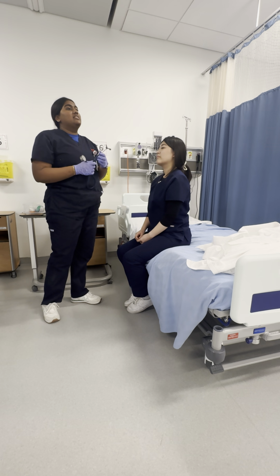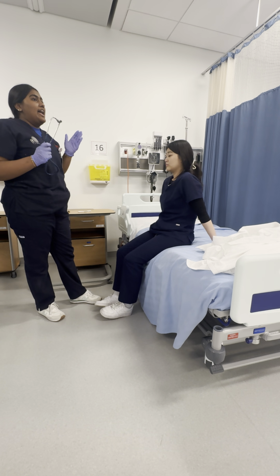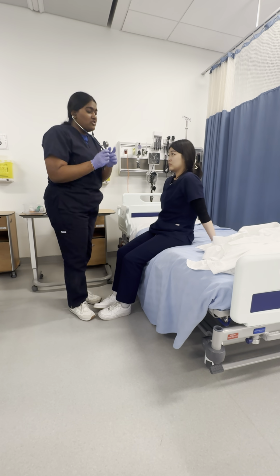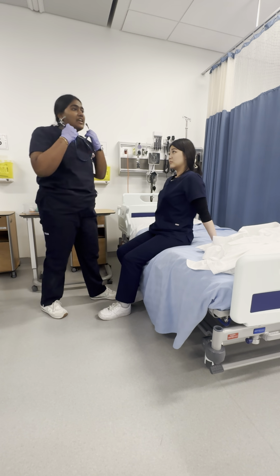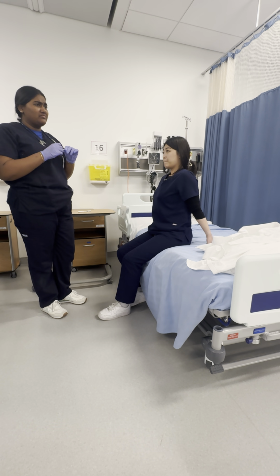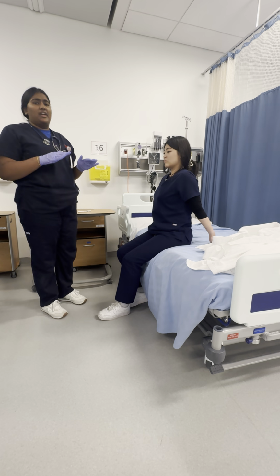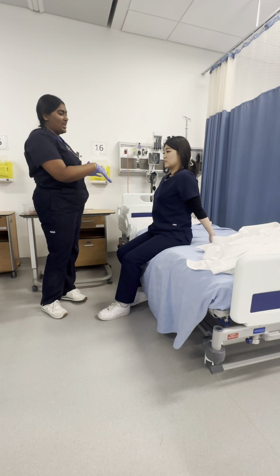Her apical heart rate was 76 beats per minute, and the rhythm was regular and unlabored. Now I'm going to see if I can hear the S1 and S2 sounds. I'm going to use the bell for it. The S1 and S2 were heard clearly. The abnormal findings would be things like wheezing, crackling, gushing sounds or throbbing sounds, but I didn't hear any of it when I auscultated the apical pulse.